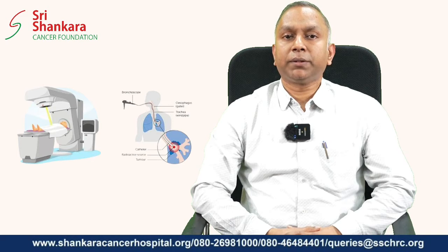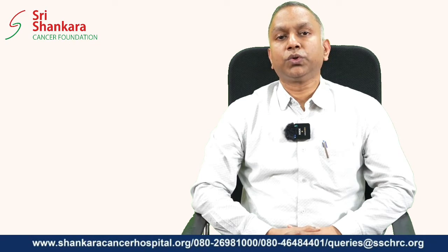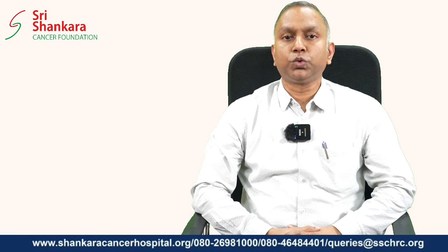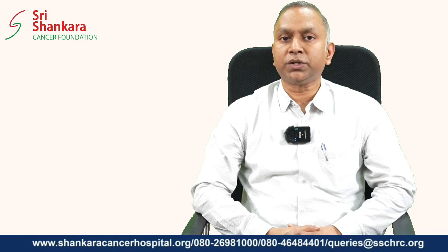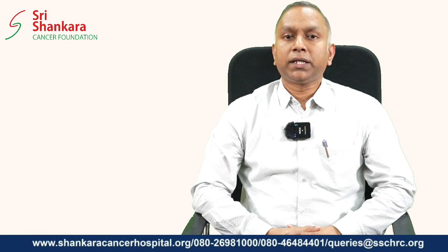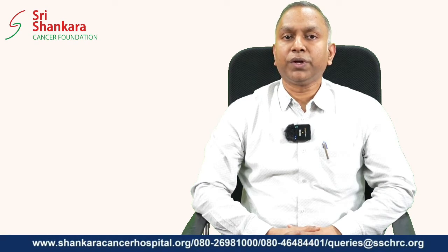But the type of brachytherapy that will be used for the esophagus is called intraluminal brachytherapy. Similar to the earlier settings, there will be 5 weeks of external radiation, following which there will be a gap of 2 to 3 weeks so that the patients can recover from the side effects of external radiotherapy. And once the patient has been decided for intraluminal brachytherapy, an applicator will be passed through the esophagus, and the radiation source will be passed through the same applicator, and the radiation will be delivered precisely to the area where we want.